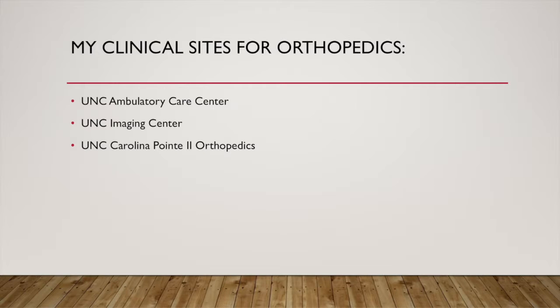Thus, the imaging protocols used at these facilities are fairly similar, such as having the patient standing upright for a lot of the exams, but there are still a couple nuances. However, UNC Hospital would require a lot of the same exams to be performed either having the patient in supine position or using other special devices for trauma patients and immobile inpatients.